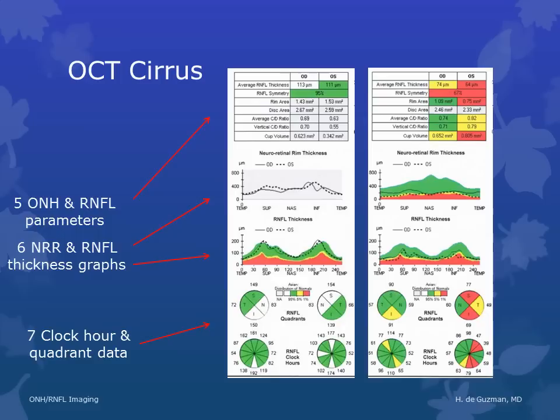Next, look at the thickness graphs. You should see a double or triple hump pattern that looks similar on the two eyes and falls within the green area — a little bit above the green area is still okay. In glaucoma, the RNFL thickness graph loses its double or triple hump pattern and falls into the red and yellow areas. The latest software also allows us to look at the neuroretinal rim thickness compared against the normative database, divided into clock arcs and quadrants color-coded for easy determination of normality or abnormality.